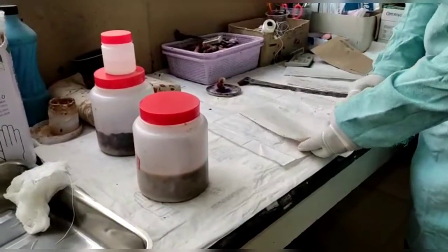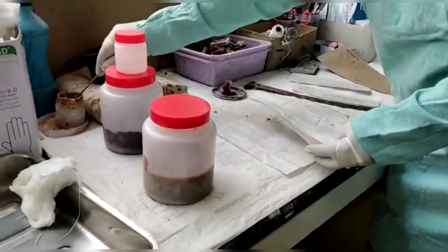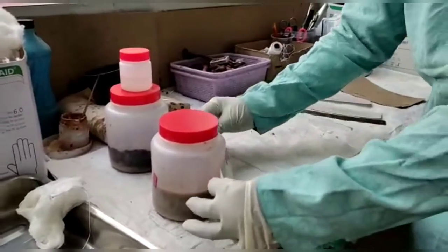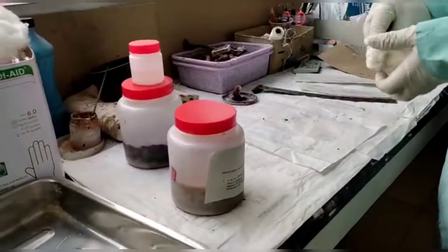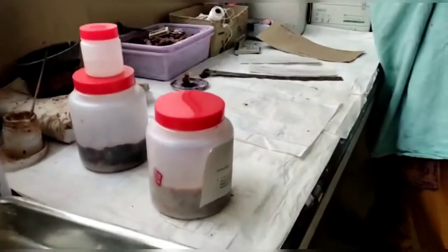First, you can see that the person is labeling the Viscera. It contains the name, age, postmortem number, crime number and police station.